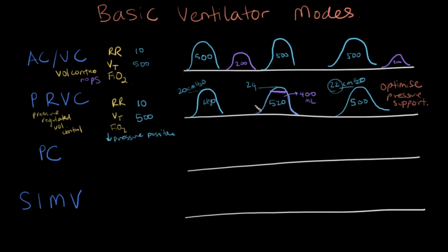And so you can see if the pressures are too high, then what actually can happen is a respiratory acidosis, where the patient is not ventilating enough. So it provides that kind of backstop to make sure that patients are not having inspiratory pressures that are too high.